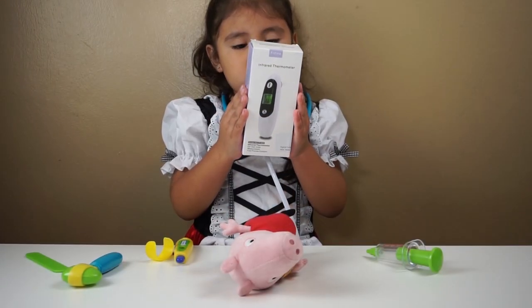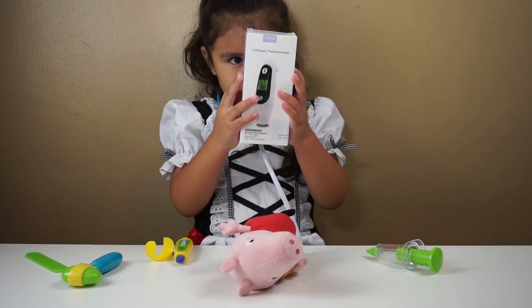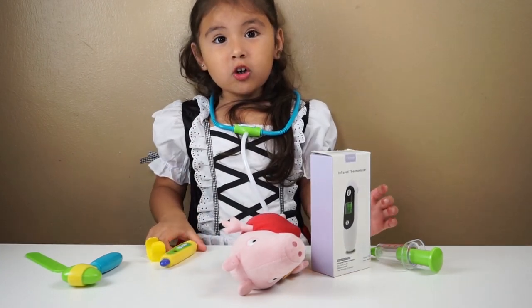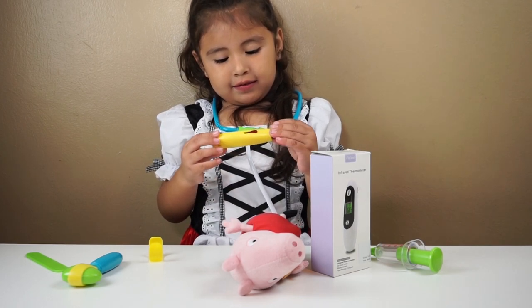So today Allie received a thermometer from Fit First. So thank you, Fit First. We're sending this. It's doctor and we're gonna review this thermometer and see how it works.